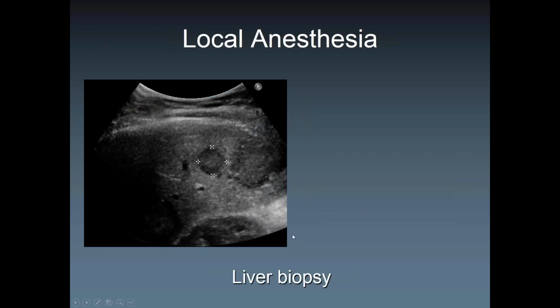Okay, let's get a little serious now and look at a few pictures and targets, because now we're going to see how we're going to numb up on our way to the target. So that's the liver. There's a few mets in here, or target lesions. So whatever we're going to biopsy, we call it target, right? But within ultrasound, you have a so-called target appearance. That's a different thing, right? The target appearance is a concentric, well-defined lesion which has a hypoechoic halo in the periphery mostly. That's classic for a met, right? This patient obviously has mets, but they were to be biopsied.